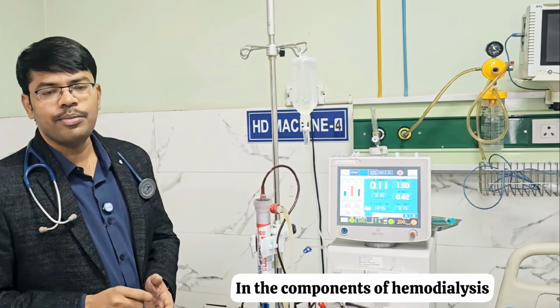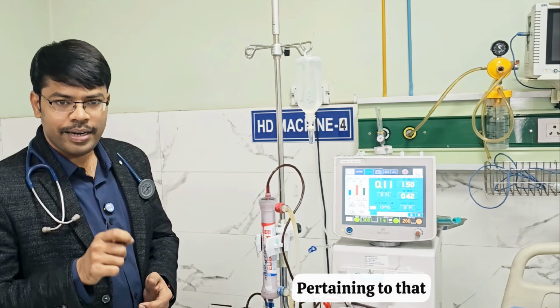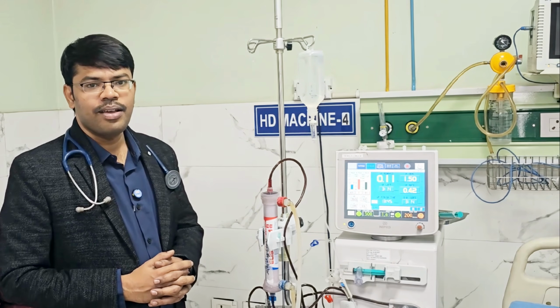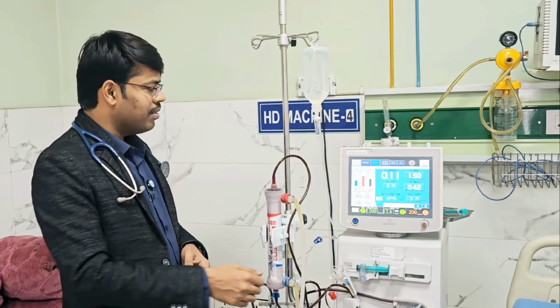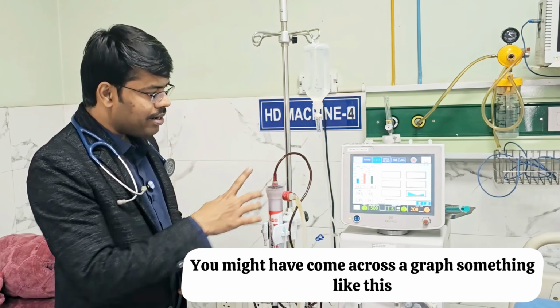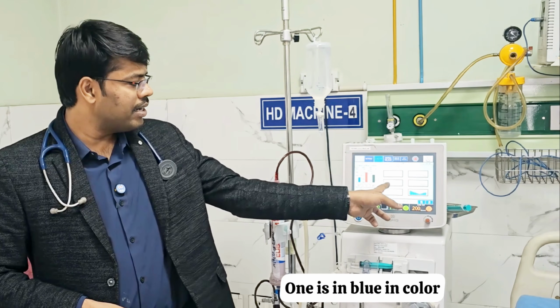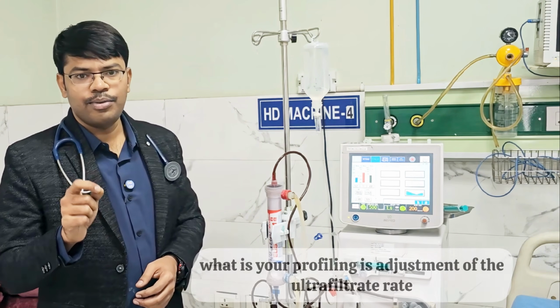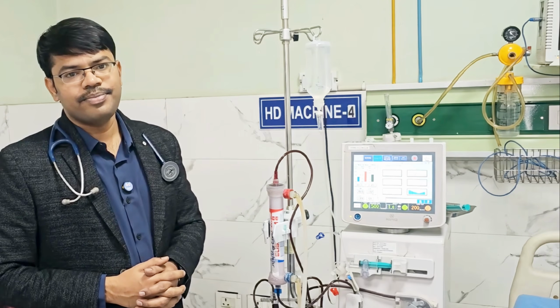In the components of hemodialysis, we have seen one parameter called ultrafiltration. Pertaining to that, one component in the monitor, ultrafiltrate profiling. What is ultrafiltrate profiling? You might have come across a graph, something like this. There are 6 graphs. One is in blue in color, rest all are in white. In simple terms, profiling is adjustment of the ultrafiltrate rate.